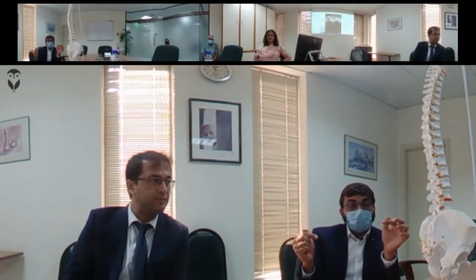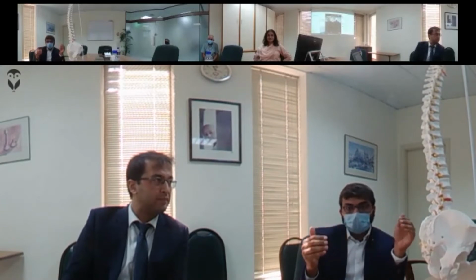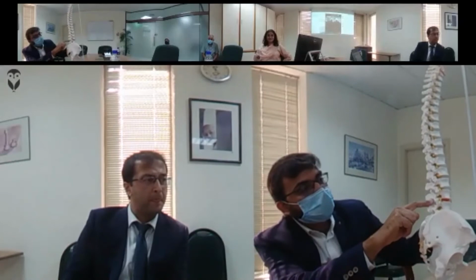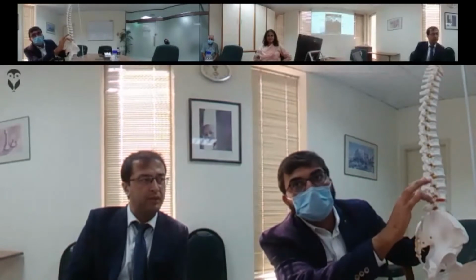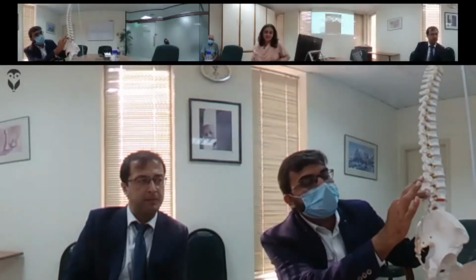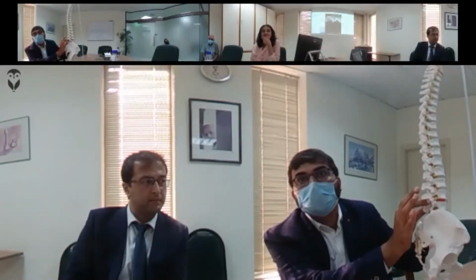In one side, it may not be reaching. Obviously once you see the contrast there, it may be reaching. But if you're injecting from both sides, like for the same disc L3, if you're injecting from here, your medication is going to cover the internal part as well. If you're injecting from there, it's going to cover the outer part as well. We know we have given the contrast and we can see the spread going in as well, but it's just to make sure we're covering both parts.